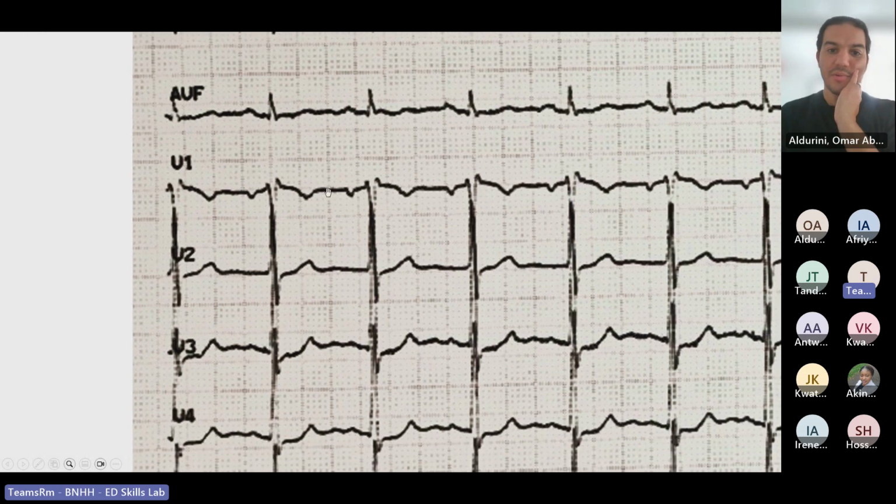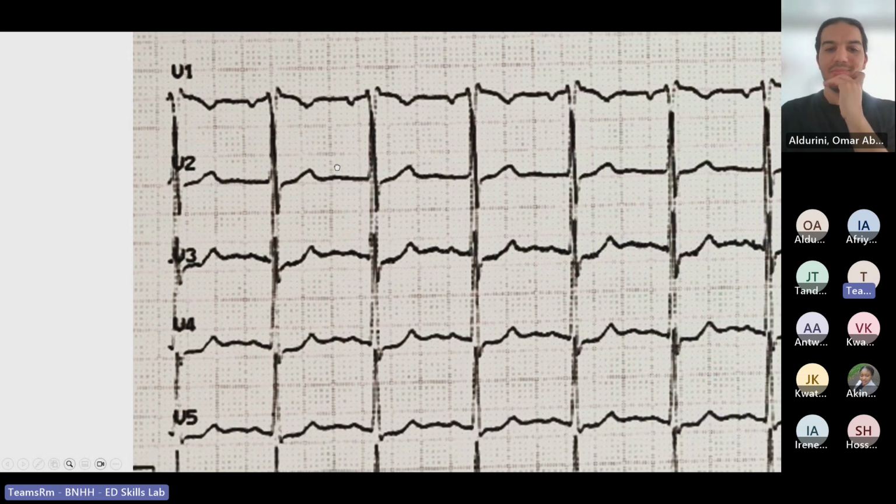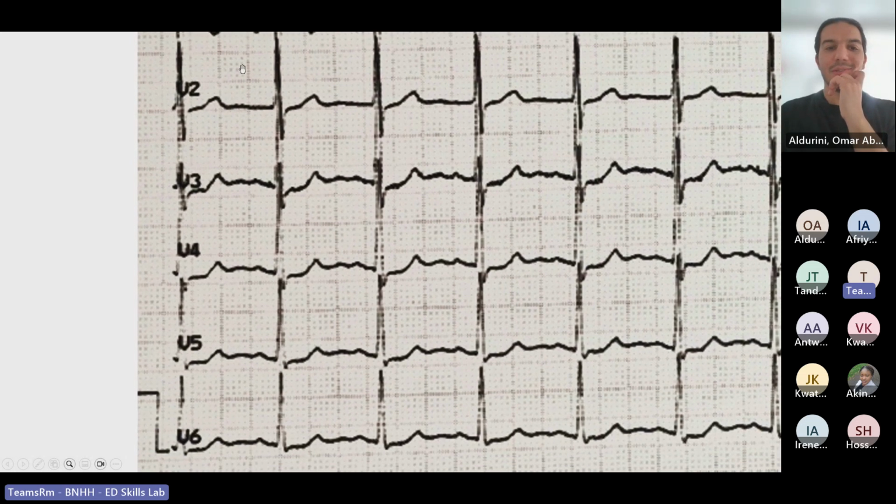Okay, good. That's good. V1: elevated just slightly. Yeah, good. What about the rest, the V leads?